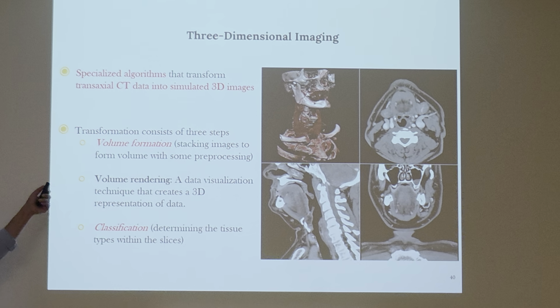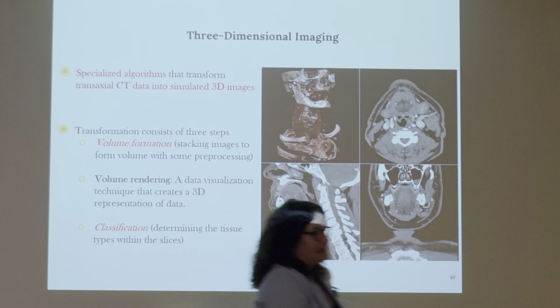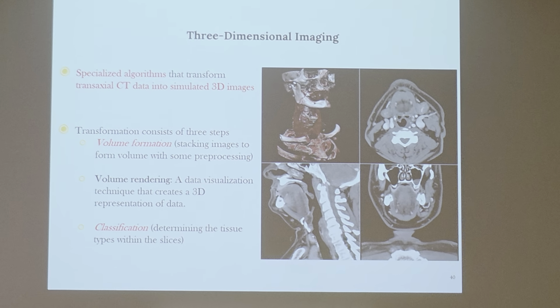So when we think about the special algorithms that are used to transform this into this, this started with ones and zeros, crests and valleys, crests, valleys. That's all it is. Isn't that amazing? It's amazing to me how long we've come.